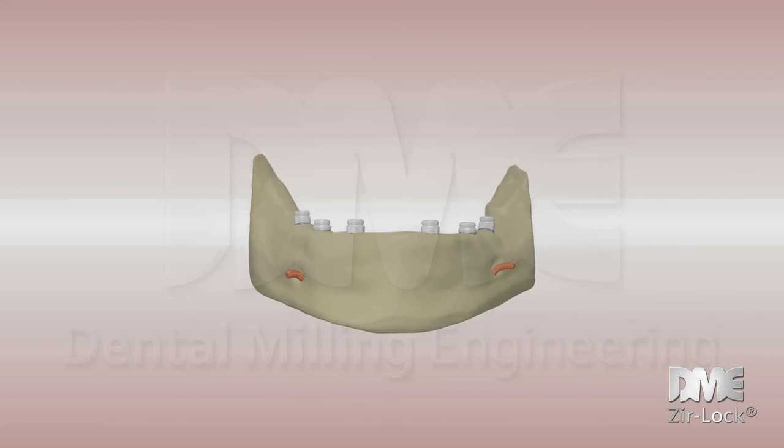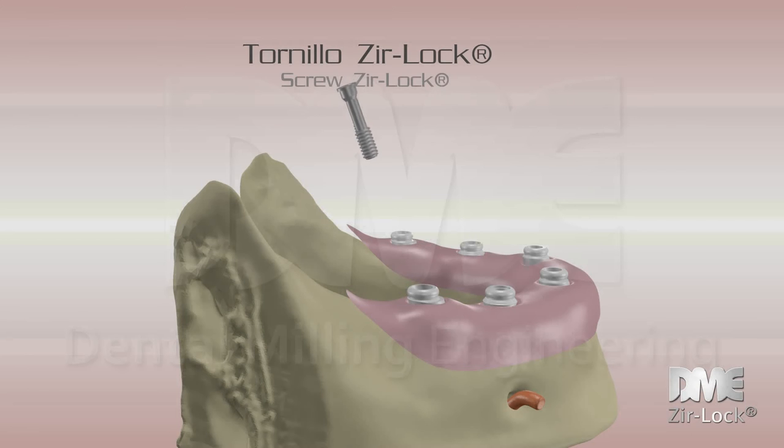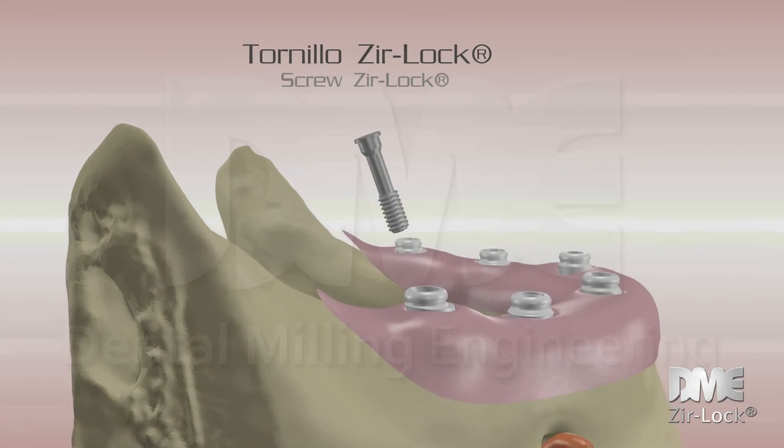It is observed how, despite the divergence of the implants, the 6 heads of the Zir-Lock males are completely parallel to the plane of insertion. This is what prevents, in the act of placing the prosthesis, the risk of smudging retainers. It is advisable to place the Zir-Lock and screw one by one for a subsequent visual inspection, checking that the heads of all the males are in parallel positions.